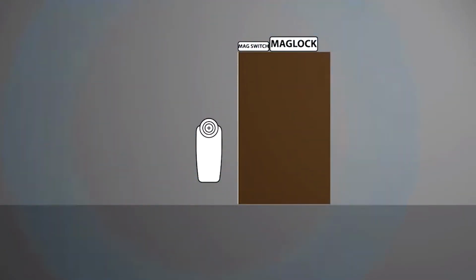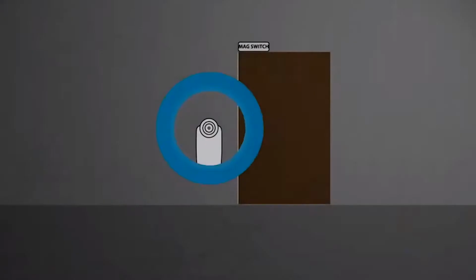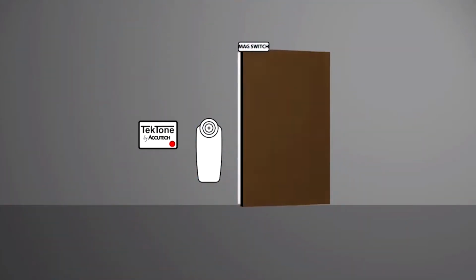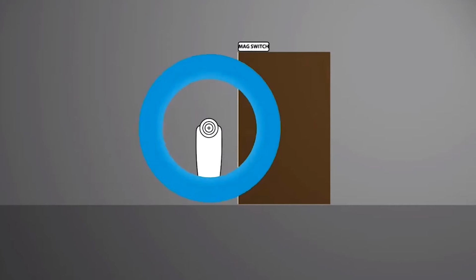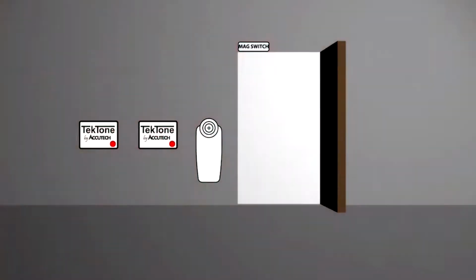System functionality is depicted by the following animation. When a door controller sees a tag, the door restraint will be activated. If a tag stays in the transmitted field for more than 10 seconds, a loiter alarm is generated. If a door is opened without entering a proper keypad code, an alarm is generated and tag information is displayed. It is important to note that the door controller cannot differentiate between multiple tags. Alarms generated while more than one tag is present will display information regarding door location only.